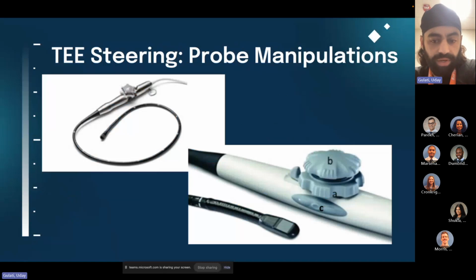And so this is what your probe looks like, right? And obviously it varies. So once again, you guys see the probe on the bottom right, that distal tip just as small as your finger. And you see this indentation, right? That is the side that you are going to enter it with.